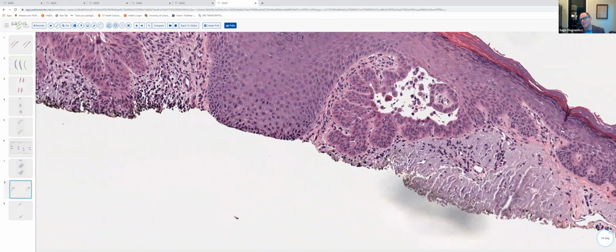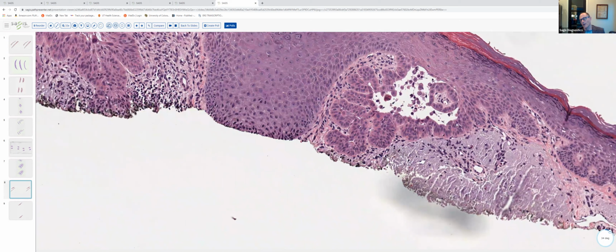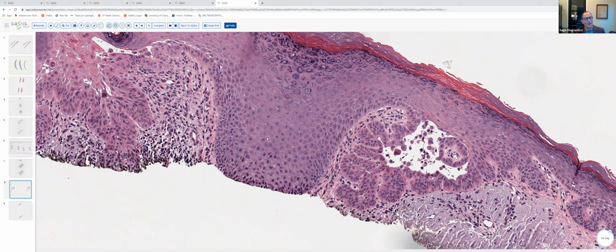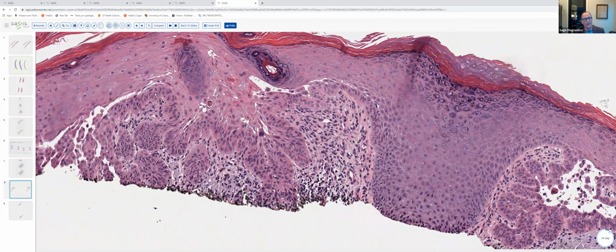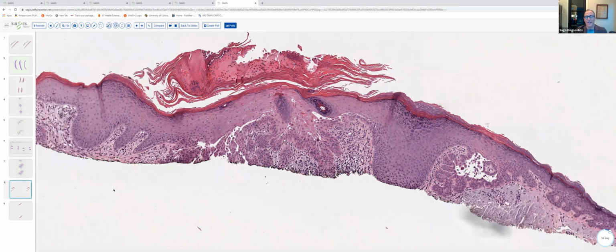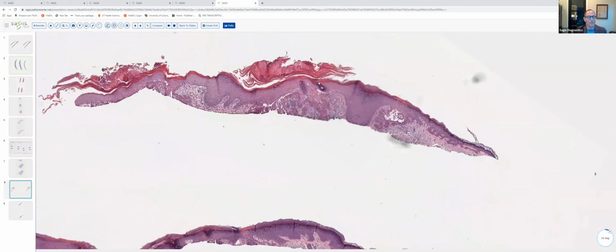And we've got buds of atypical keratinocytes with clear-cut crowding of the nuclei and some nuclear pleomorphism, an overlying parakeratosis, buds and cords of these atypical keratinocytes attached to the overlying epidermis by necks. Notice, though, that we do have acantholysis and dyskeratosis. Again, some more buds of atypical keratinocytes with some acantholysis and dyskeratosis. So much as one can see acantholysis in a squamous cell carcinoma, you can also see acantholysis in an actinic keratosis.